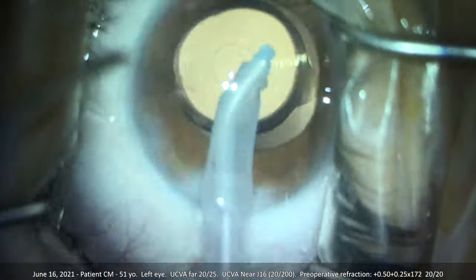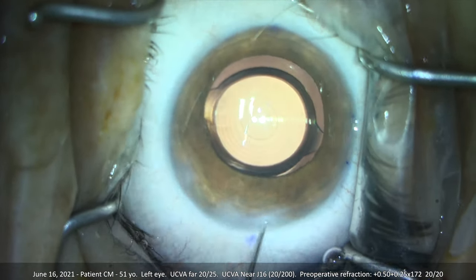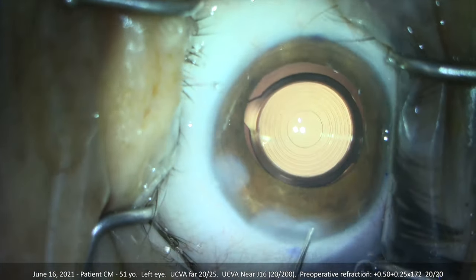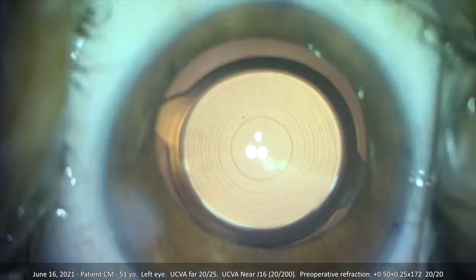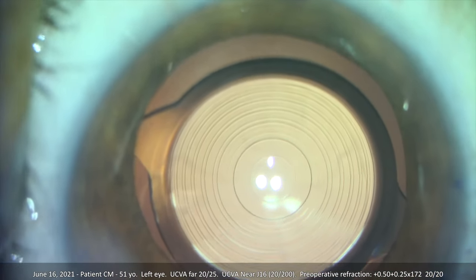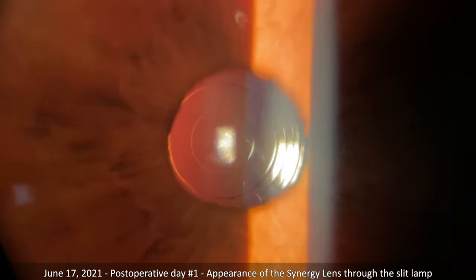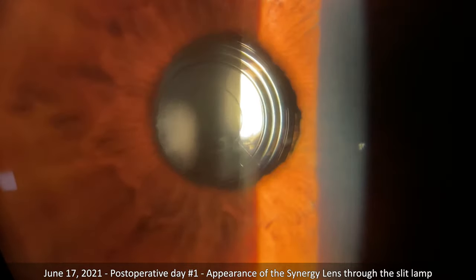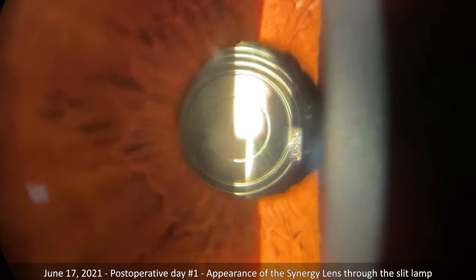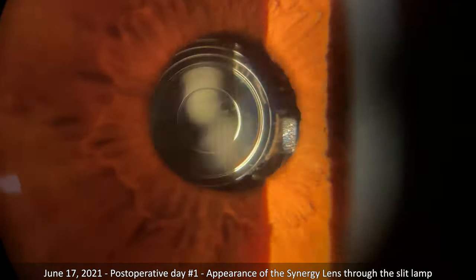We remove her natural lens and then insert one of our first Synergy lenses. The lens is made of the same acrylic material as the Tecnis multifocal and the Symfony lenses. I love the lens material and lens platform as it looks absolutely spectacular inside the eye. On her first post-operative day, the Synergy lens looks perfectly centered and clear through our slit lamp microscope.